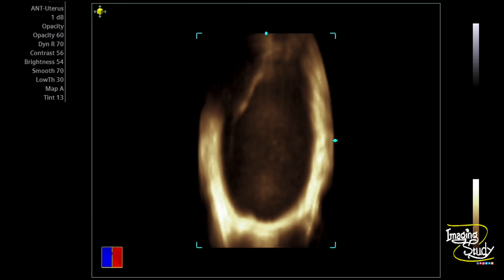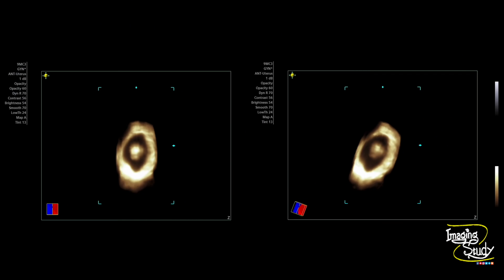My transvaginal transducer was a regular 2D one, but it can reconstruct a 3D image by manual movement. We took a 3D image — though it's poor quality — because I wanted to show you something specific. I asked how you can confirm that calcified structure as a tooth. Here in this picture made from the 3D data, you can see the calcified structure within the cyst cavity. In my opinion this structure is a molar tooth — what do you think? Tell me in the comment section.